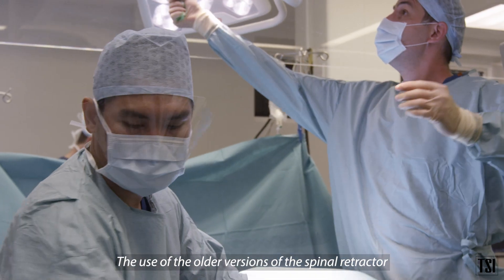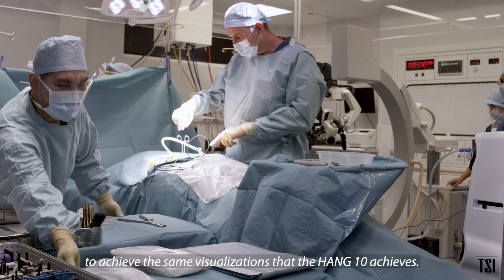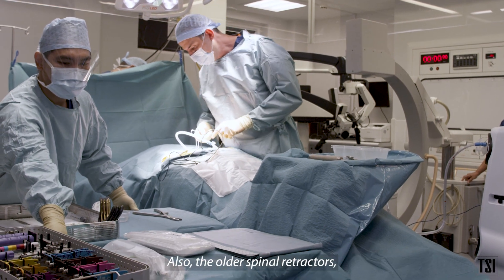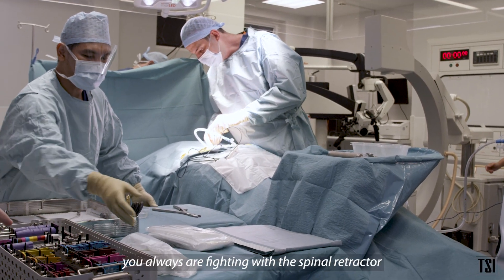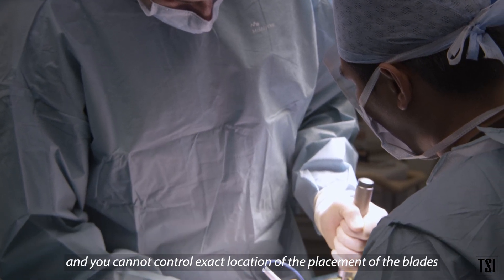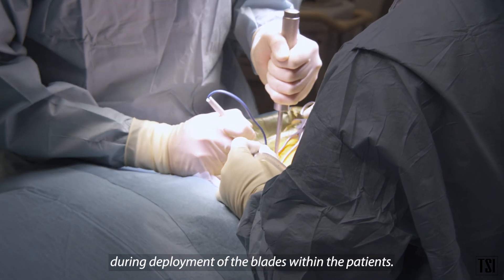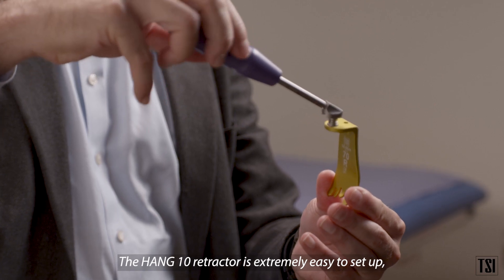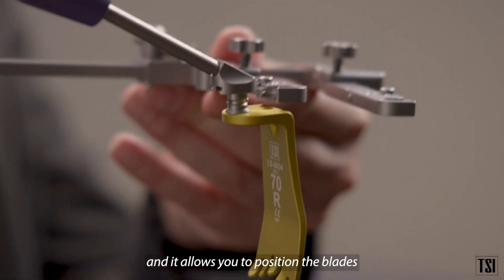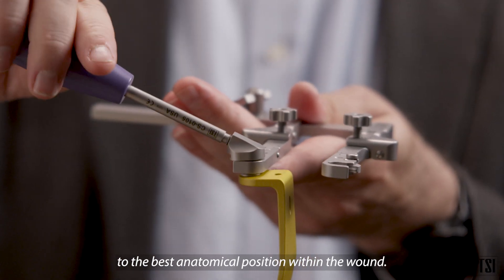The older versions of spinal retractors usually require a bigger skin incision to achieve the same visualization that the Hank 10 achieves. With older spinal retractors, you are always fighting to place the retractor within the patient, and you cannot control the exact location of blade placement during deployment. The Hank 10 retractor is extremely easy to set up and allows you to position the blades in the best anatomical positioning within the wound.